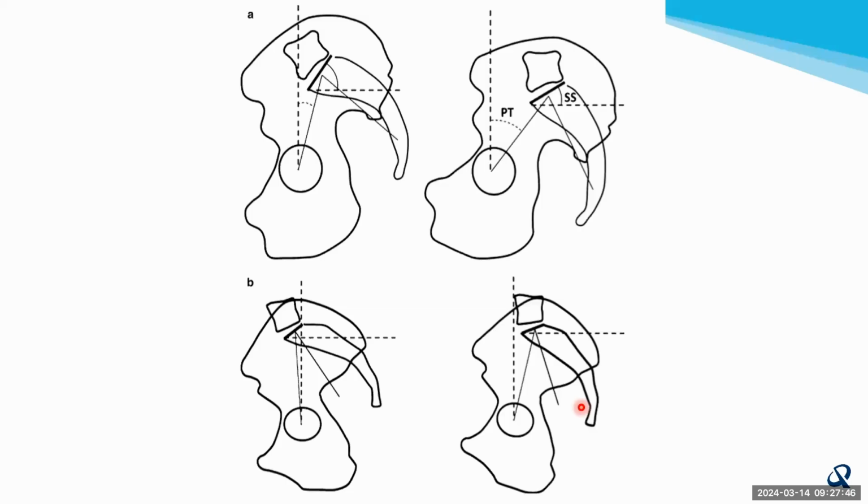And I wanted to spend a little bit of time talking about some pelvic angles. I know this is probably the only part of the talk where we talk about angles in a little bit of detail, but stick with me, and hopefully some of you might learn something. A lot of you will already know these facts. So I wanted to focus on just two pelvic angles. The first one's really simple.